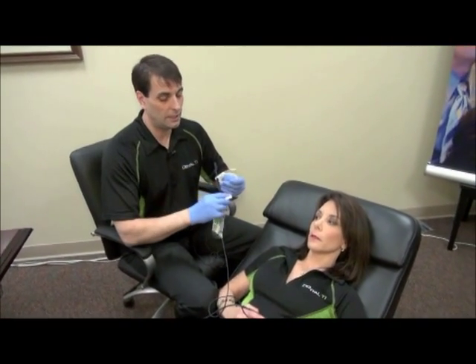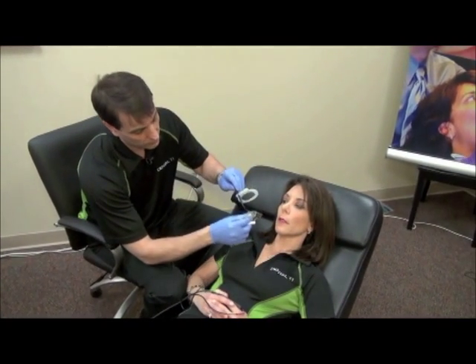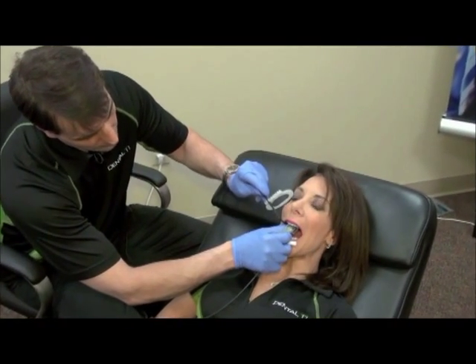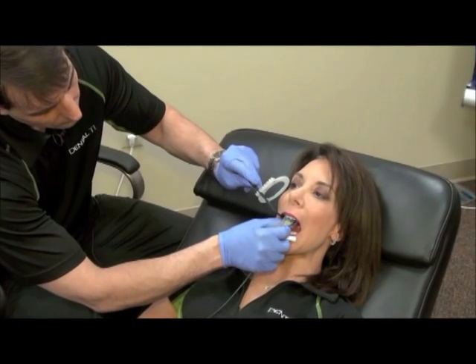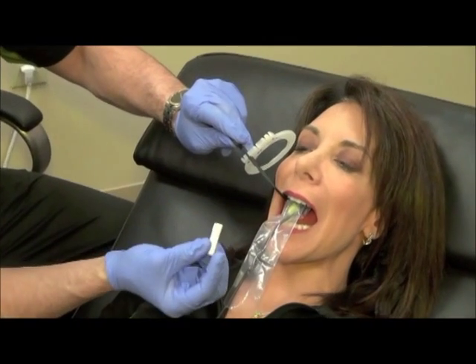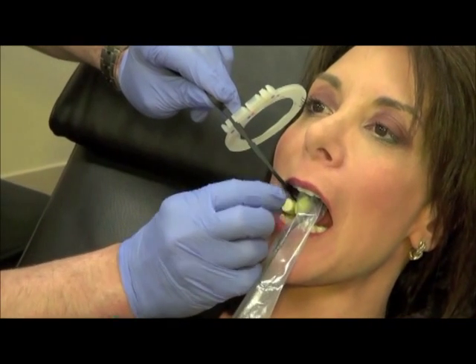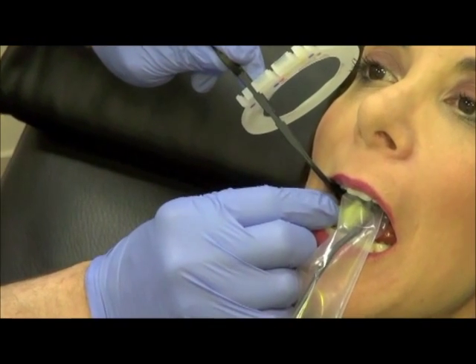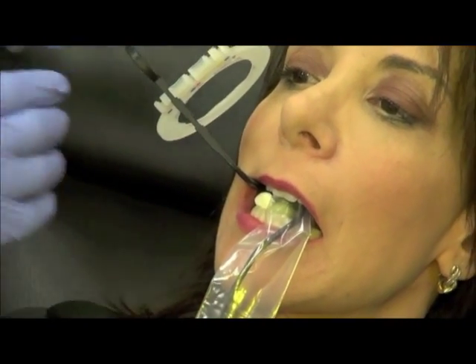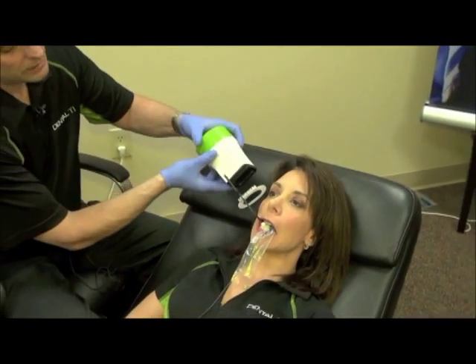I always say have a cotton roll — it's very handy for stabilizing the sensor. We're going to use the middle of the patient's palate where there's the most space. I'm approaching at a 45-degree angle and then I take the biting surface of the Trollbite and push it up against the maxillary occlusal surface to stabilize. Then take the cotton roll between the mandibular surface and the bite stick on the Trollbite and put it on the mandibular. The patient can close comfortably and we maintain the angle that we need to pick up the apices.